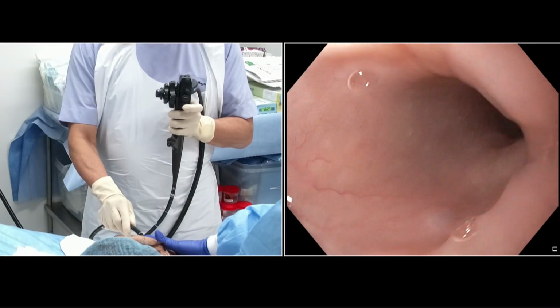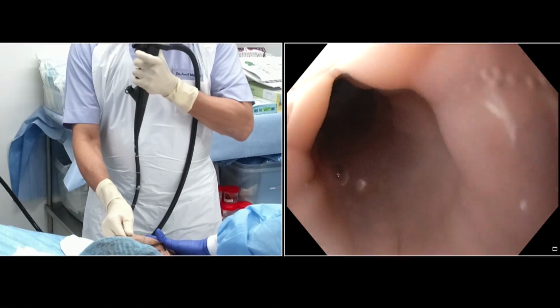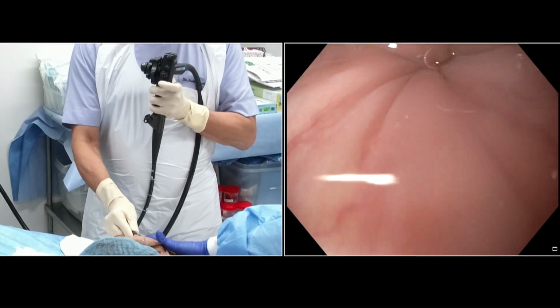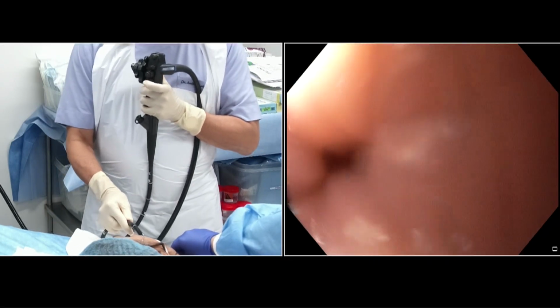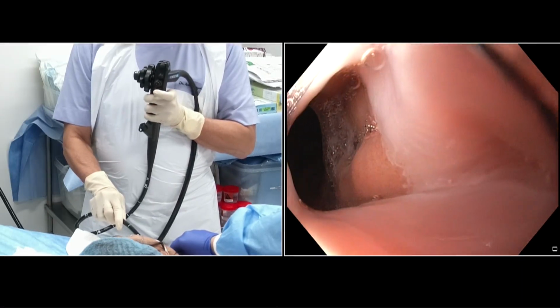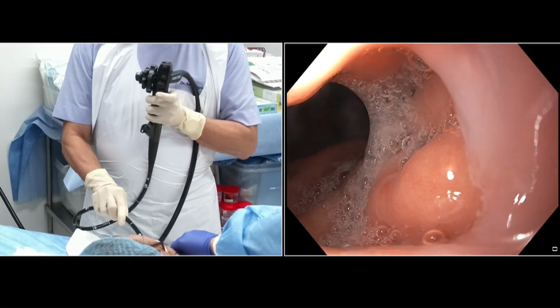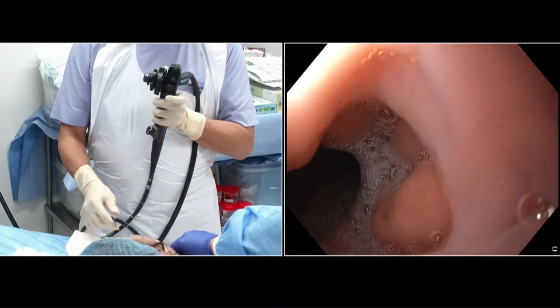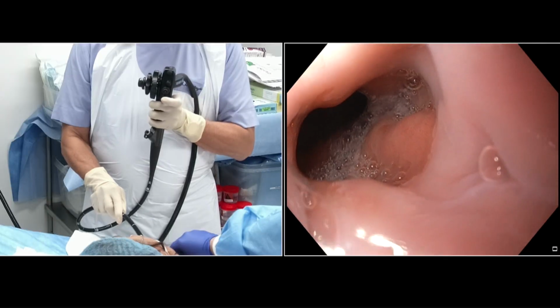Then I keep on going ahead and keep on turning the scope by moving the control section with your left hand and turning the shaft right and left. As I keep going ahead, I slowly come to an area which is the esophago-gastric junction. Now see here, I am gently passing the scope inside, and at this area you can see there is a change in the lining. Below you can see the lining is pink, above the lining is a little pale. The pale mucosa is the squamous epithelium of the esophagus, whereas the pink mucosa is the columnar epithelium of the stomach. So here you can see is the esophago-gastric junction and the Z line.